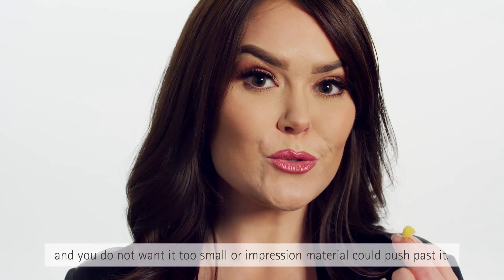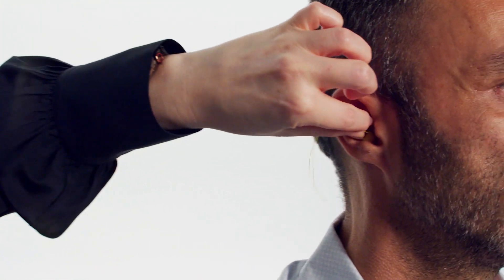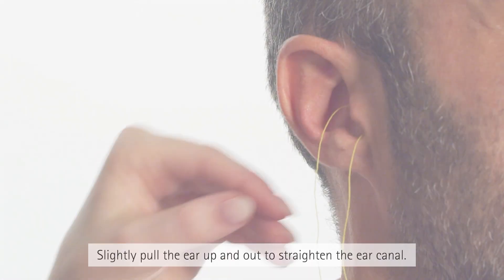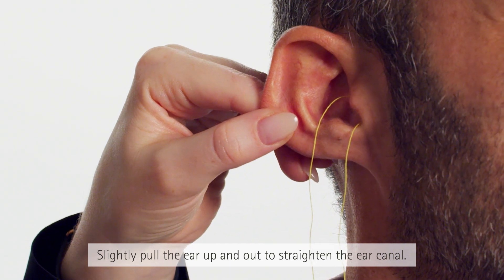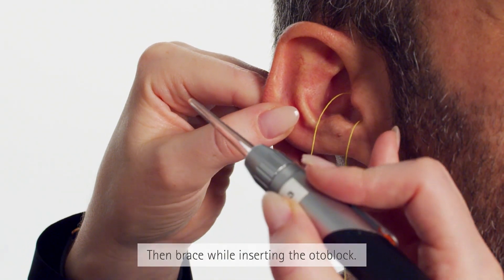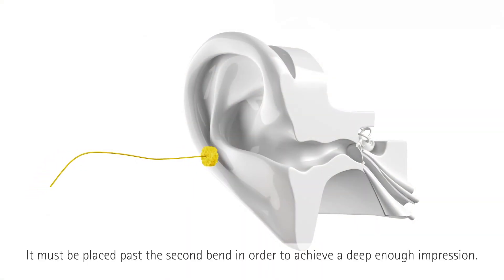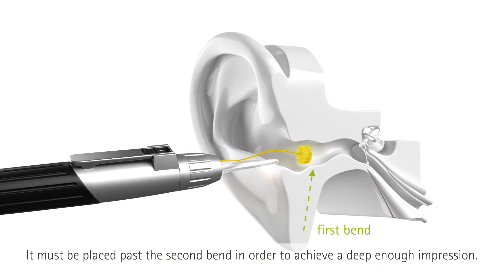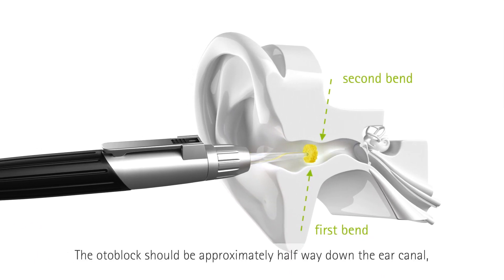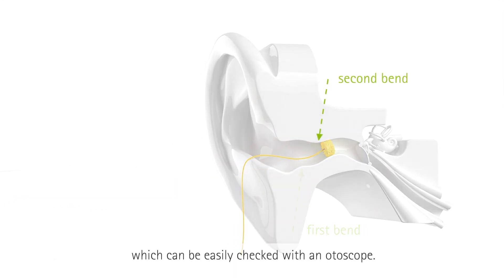You don't want the Otoblock too big or it will create pressure in the ear canal, and you don't want it too small or impression material could push past it. Slightly pull the ear up and out to straighten the ear canal, then brace while you insert the Otoblock. It must be placed past the second bend in order to achieve a deep enough impression. The Otoblock should be approximately halfway down the ear canal, which can be easily checked with an otoscope.